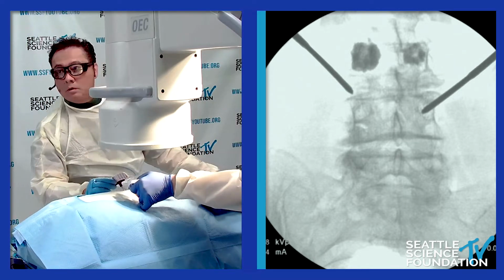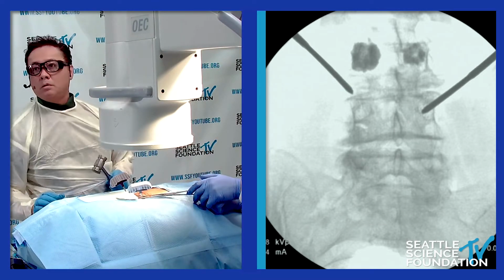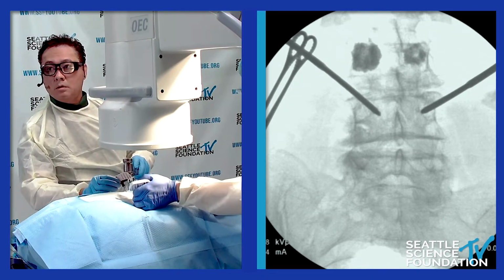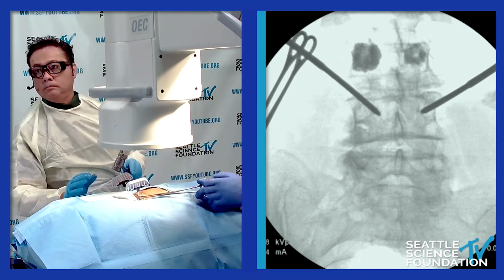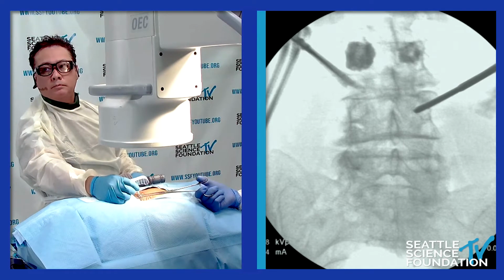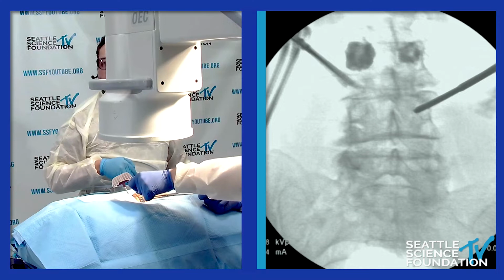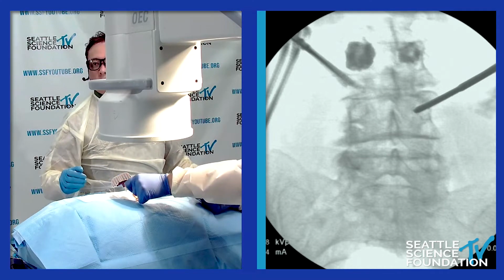So some of those tricks are to start very lateral, and as you start advancing the needle, you sometimes can go extrapedicular and then be able to reach the vertebral body itself. Come up more lateral to bypass the danger zone, where the canal is.